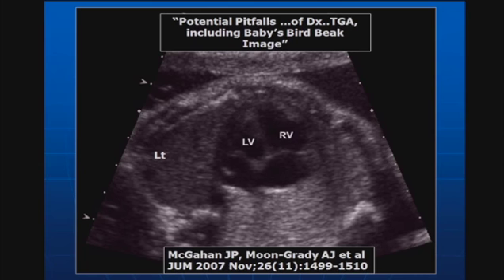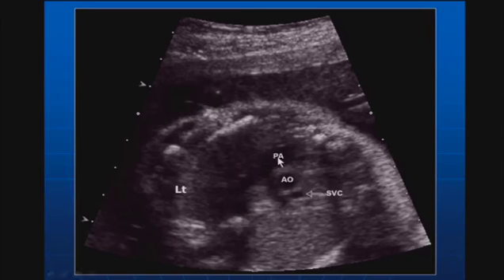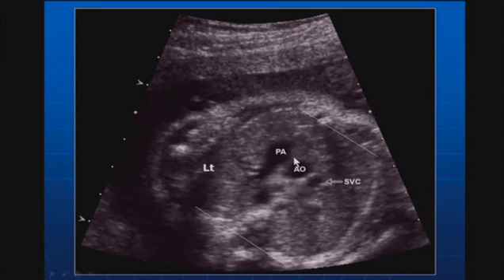So if we look here, we see a normal 4-chamber. That would be our second view. We actually see a 5-chamber, and in that, we're going to see the right ventricle outflow tract and the left ventricle outflow tract cross. We go up one, and that thing from the right is going to come over to the left. The aorta is underneath there. It's the midline, and this is the superior vena cava. And this is what it looks like on a higher view, and there's one other higher view that I'll show you: pulmonary artery, aorta, and SVC.